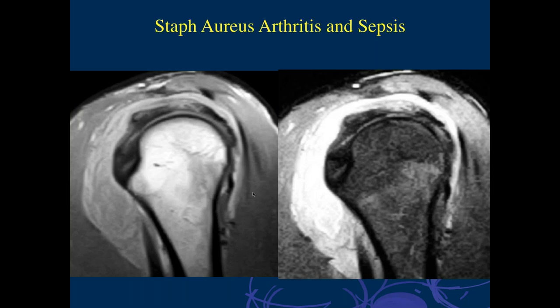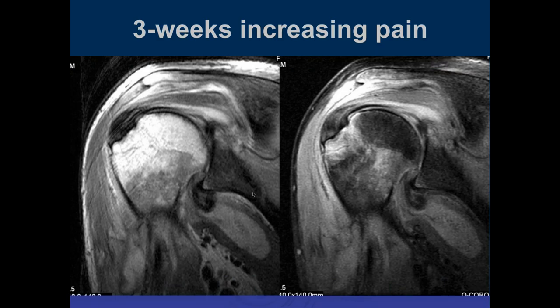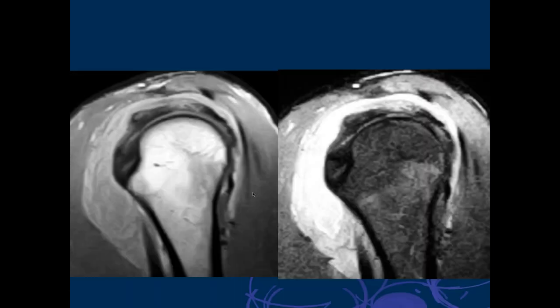There's not much edema in the bone, in bone marrow. Yeah, not at this point. Okay. Wait a second. Let me think. I think this. Okay.